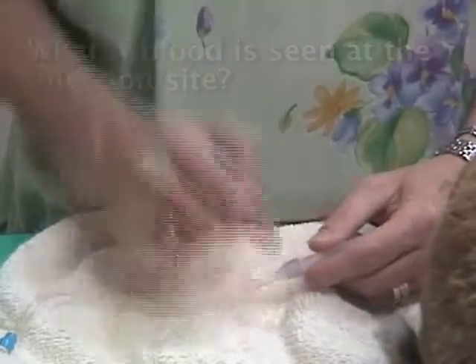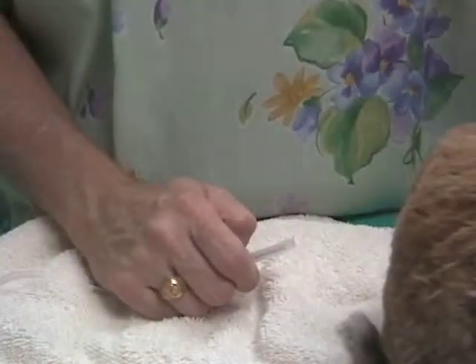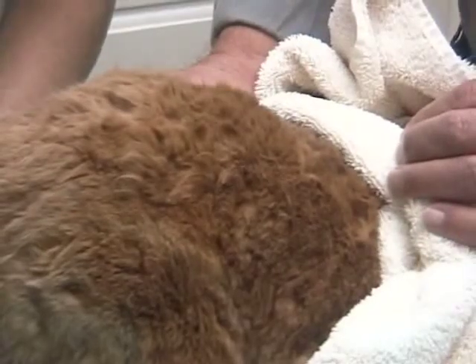That could be, and usually is, just a skin capillary. You can apply pressure, either pinching the insertion site or put pressure directly down on the site, and that usually will stop shortly after.